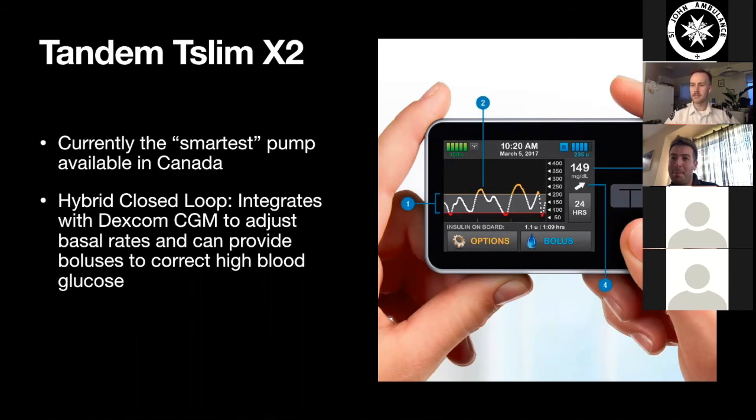Kyra's only question is, can these Bluetooth pumps be hacked? In the sense of, if you want to intentionally link into them and manually do it, yes, it's possible. In terms of vicious hacking, I don't think so. When there was the last big Bluetooth vulnerability, all these companies put out statements saying essentially their pumps weren't affected by it. And even then, I think you would have to do something quite sophisticated to somehow trick the pump into believing that the sugar reading it was getting from the Dexcom was super high. It would be a very strange, very specific thing to hack. It's certainly not something where a hacker could just hack into the pump and deliver 50 units of insulin to try to wipe you out.